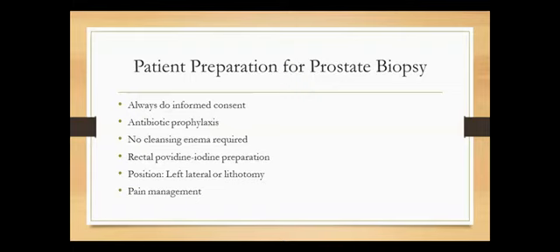Depending on your local institute, we give a start dose, which we'll talk about. And recent evidence suggests that there is no benefit to doing a cleansing enema. The evidence recommends doing a rectal povidone iodine preparation, as has been shown to reduce chances of infection post-biopsy.